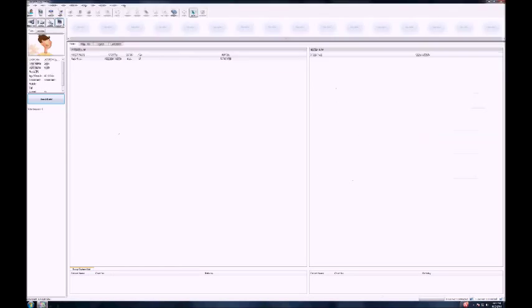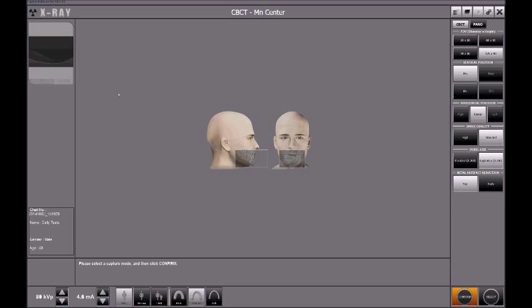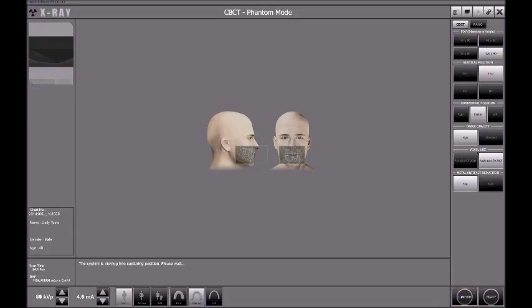The next time that you are going to perform your inspection, just select this button here that looks like a phantom, okay, like an inspection phantom, and then all your settings that were previously saved will be applied like that. Okay, so just click on the confirm button. This will make the machine start to move, get ready for the next step of our inspection.